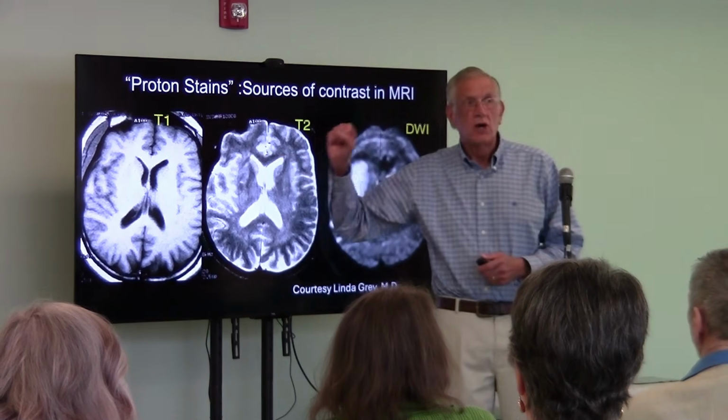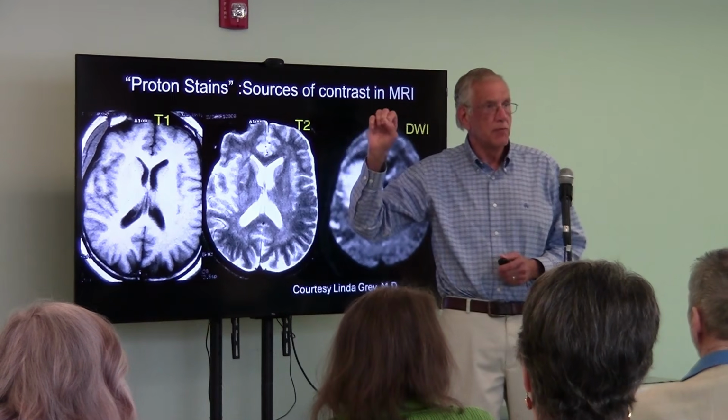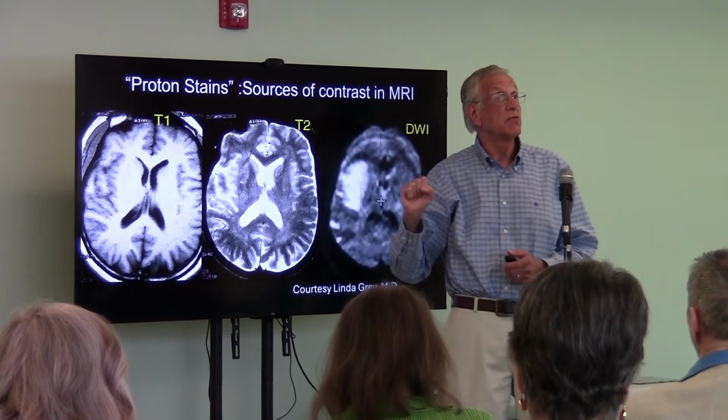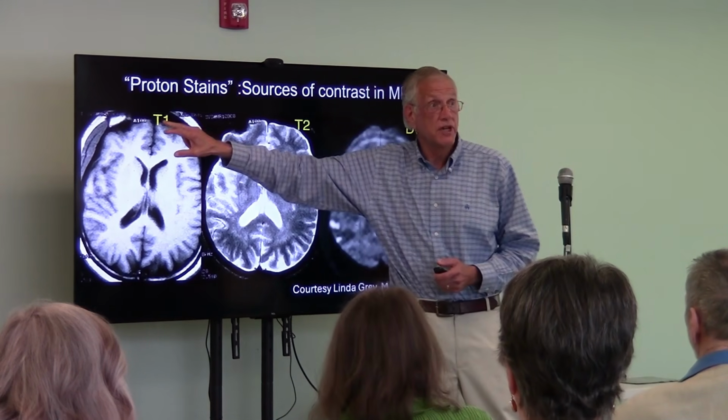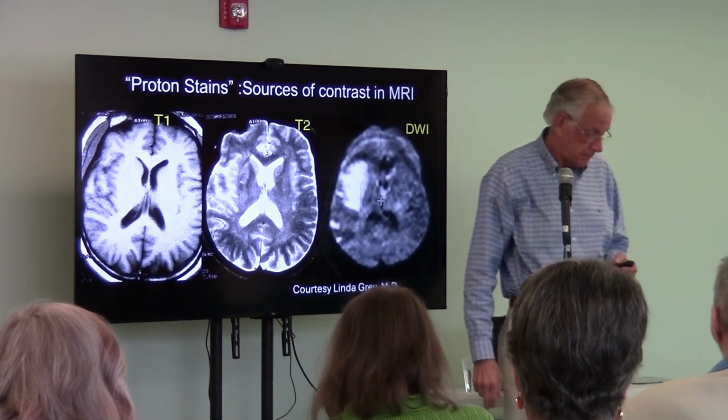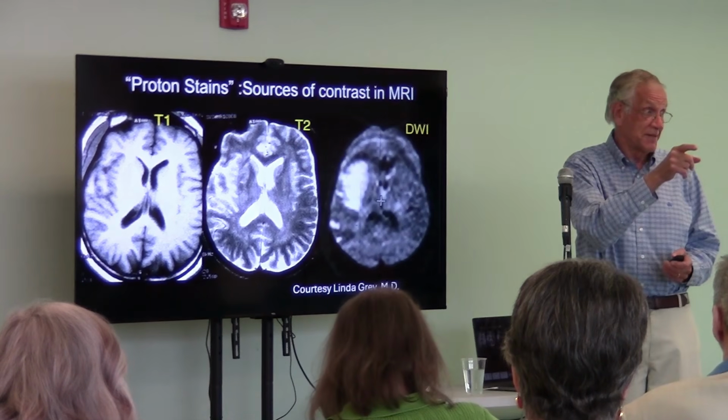And this one, it's rapidly pulsing. Okay. I'm pulsing rapidly. When I pulse rapidly, some of the tissue has not yet recovered. Yes. So this is a recovery time, and this is a decay time. Okay. All right? He's making me honest.